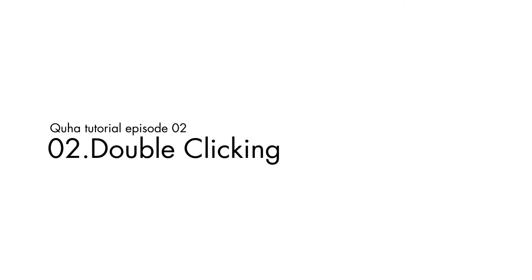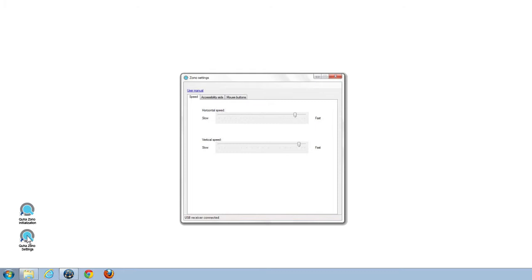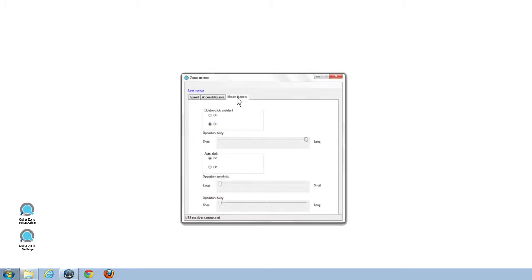For making double clicks with an external button easier to perform with ZONO, a double click assistant can be found in the mouse buttons tab in Quha Zono settings. It should be activated by default, but you can adjust the operation delay if you don't find the default settings optimal. The assistant will freeze the mouse pointer for a moment when clicking the first time to make the second click easier to perform.